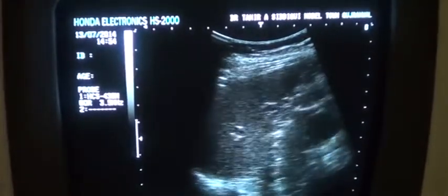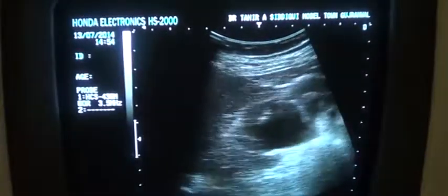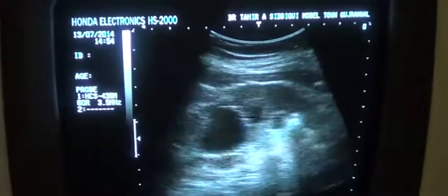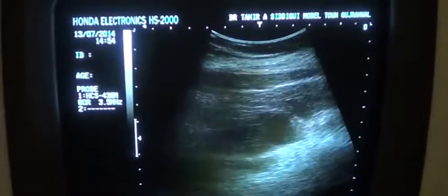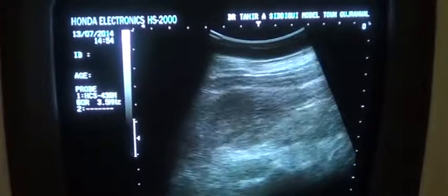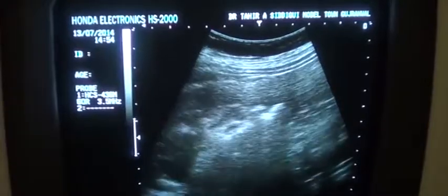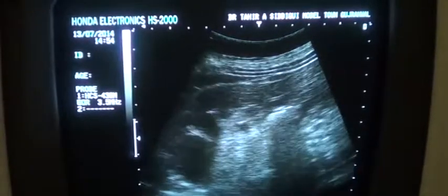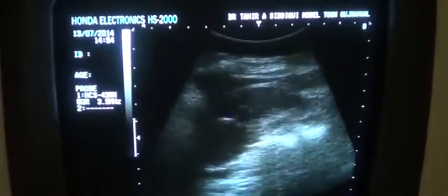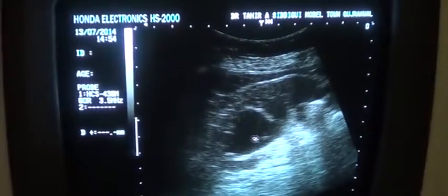Now this is the spleen in front of you, and this is the left kidney. In the left kidney, parenchymal echogenicity is preserved, thickness is preserved, the corticomedullary differentiation is preserved. What we see is, again, now you see this is the lower pole. All the calyces are dilated. Mainly the most dilated calyces are the ones at the upper pole region.